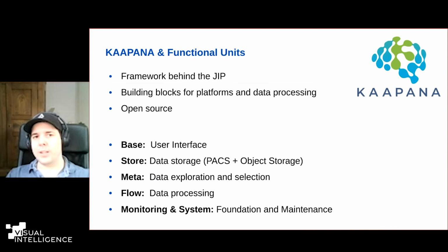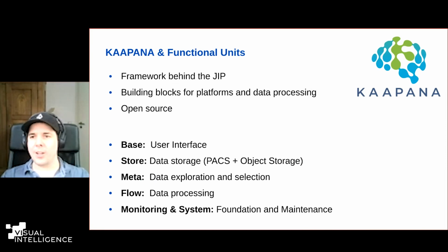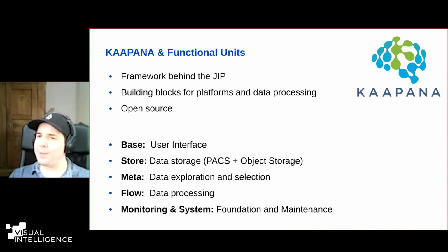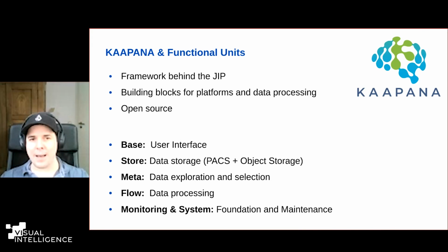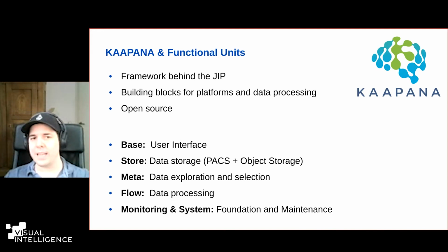All right, so now I want to talk quickly about Kaapana. And just for technically interested people, it's maybe interesting that Kaapana is basically the framework behind the Joint Imaging Platform. So for people who are not that interested, it's more or less the same. You can see it as a synonym, but Kaapana is an open source framework that we developed, and it's basically building blocks for data processing and the platform infrastructure itself.